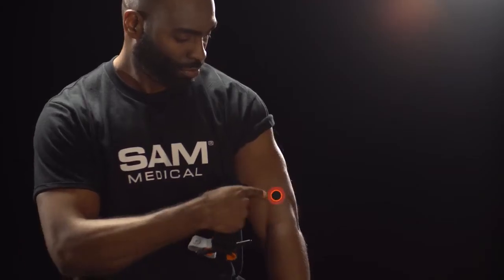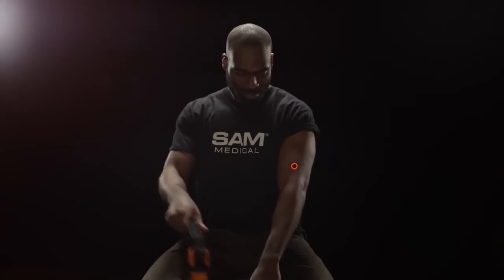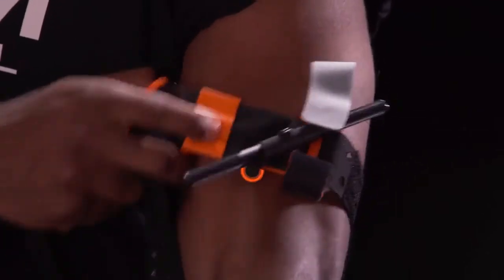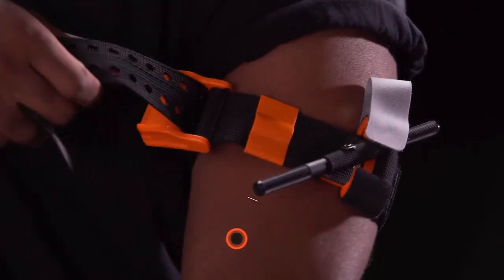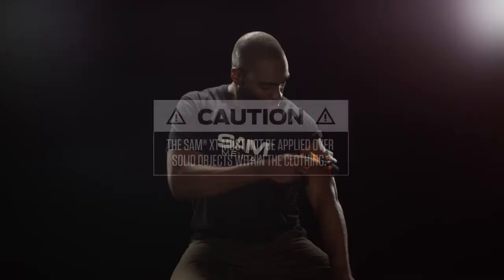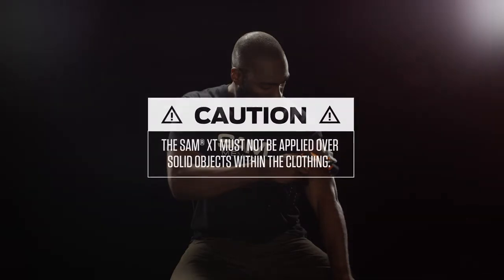To begin, locate the site of the injury. When self-applying, loosen Sam XT and slide the loop around the limb. Position Sam XT directly onto the skin, about 2-3 inches above the wound. If applied over a garment, be sure to remove any solid objects on or inside the clothing.